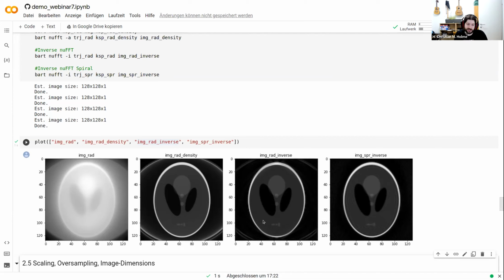For speed considerations, we basically had 8 times larger arrays. Is that correct, Moritz? Yeah. That factor was a problem with memory if you do 3D, for example, and we only just recently got that under control.